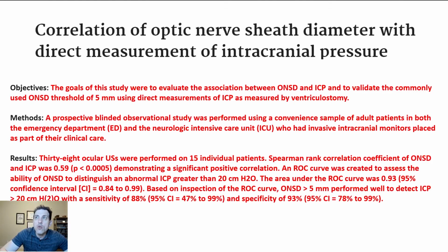So let's continue to move on here, and let's take a look at this paper. And this is the correlation of optic nerve sheath diameter with direct measurement of intracranial pressure.